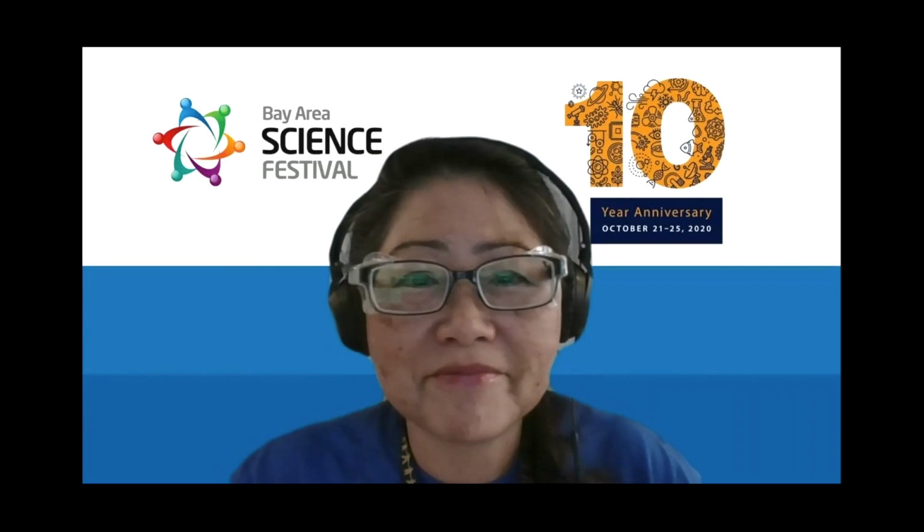Thanks, Carlos. Next question. Do you use bioluminescence in your lab? Who wants to answer that one? Prachi?